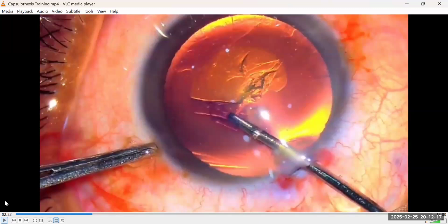The best and the standard motion in capsulorrhexis is to get a flap, flatten it on the capsule, spread it out. Make sure you see a sector forming and nudge the sector around. Centripetal pull is more like a rescue mission or a rescue effort. Now, a good capsulorrhexis is a seamless blend of both circumferential and centripetal forces all working together.